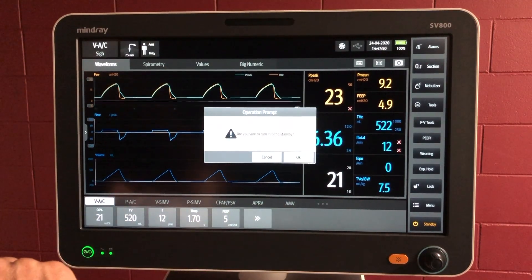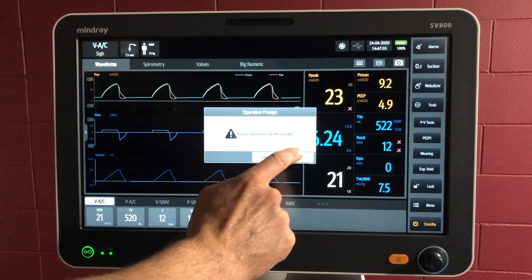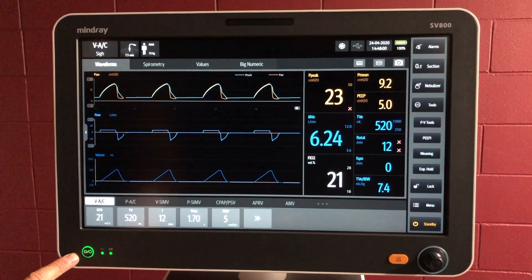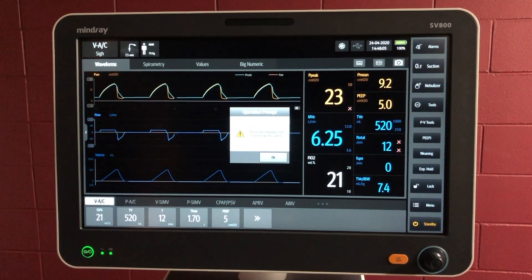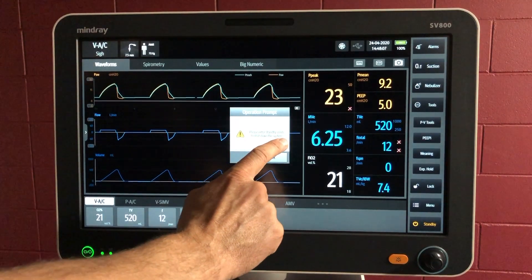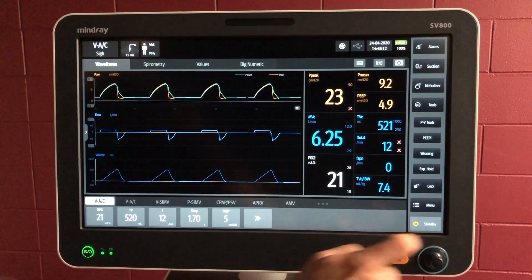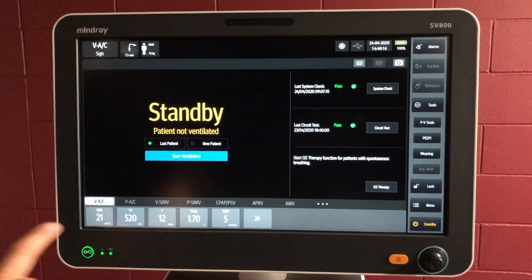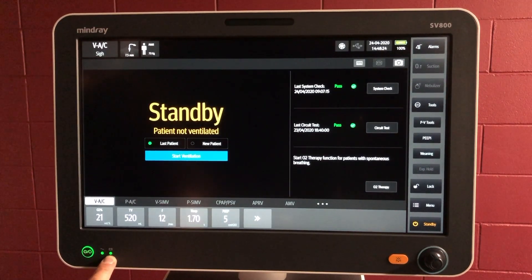And the standby button, of course, we've been using quite a bit. Pushing standby will ask: are you sure you want to push standby? Down here you've got the power button. If we push the power button, we're not going to be able to turn the ventilator off as a safety feature — it says please enter standby mode to shut down the system. So if you want to put the ventilator on standby, you have to go through there and then you can turn it off. There's also an indication here to say that we've got AC power attached and that the battery is also in there and good to go.